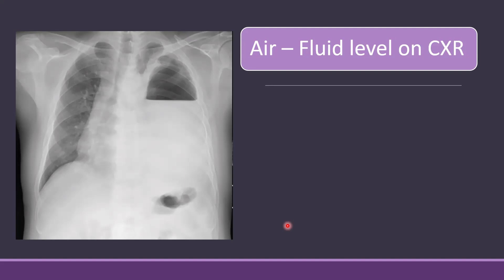So let's discuss what exactly is an air fluid level on a chest X-ray. If you look at this X-ray, you can clearly see that the abnormality is on the left side. If you concentrate on that abnormality, you can see that there is a straight line, and on top of that straight line you can see a black area.